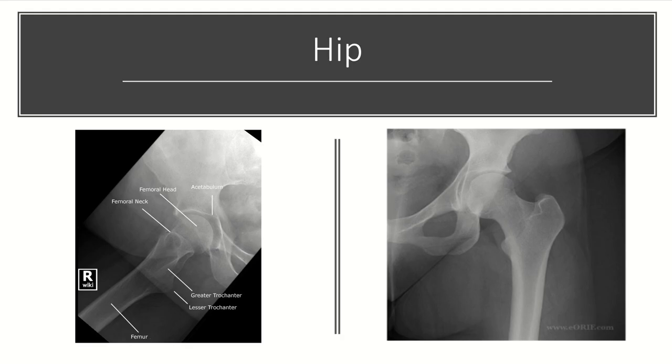The hip series typically includes an AP of the pelvis, as well as an AP and a lateral of the hip. The AP of the hip is pretty much a straight shot, just trying to visualize the joint space. On the lateral, you would like to see the femoral shaft, femoral neck, and femoral head relatively in line. Recall that the lesser trochanter is a posterior structure.